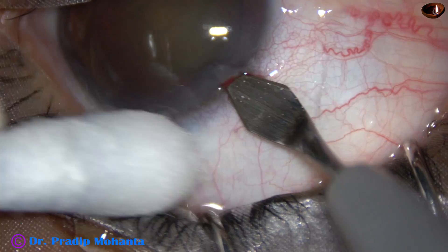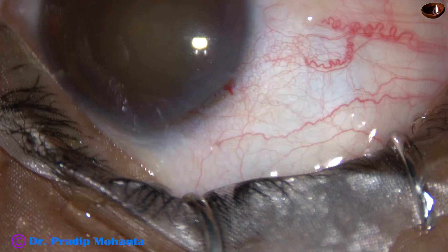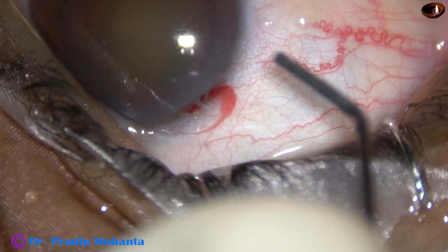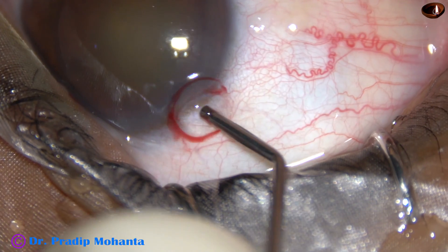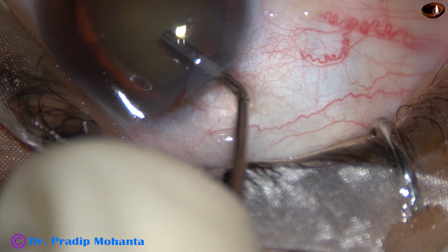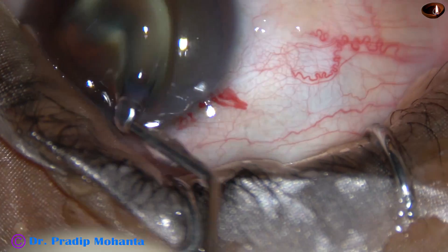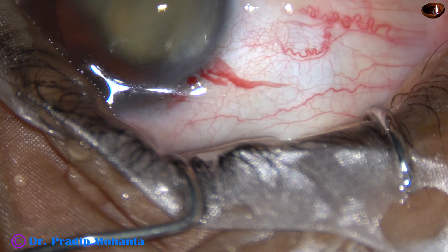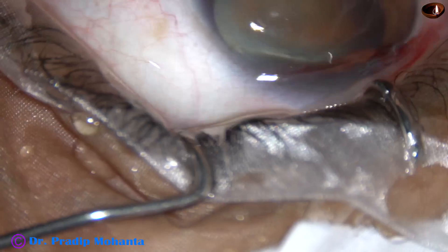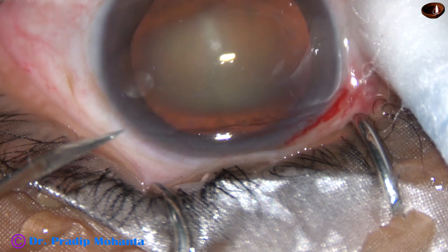This is the main incision on the posterior aspect of the limbus. Now, visco is injected into the anterior chamber and it is spread over the corneal epithelium. And now, one paracentesis is to be done.